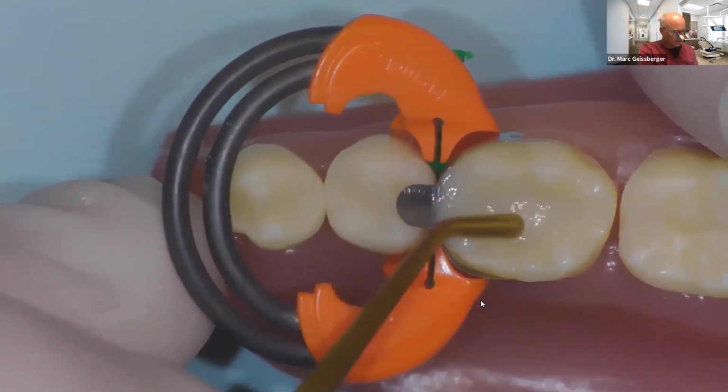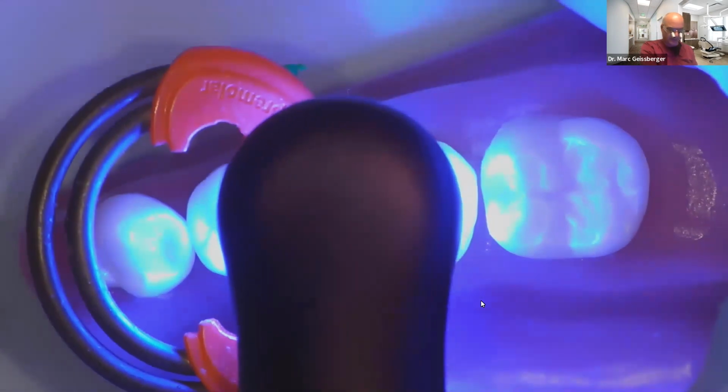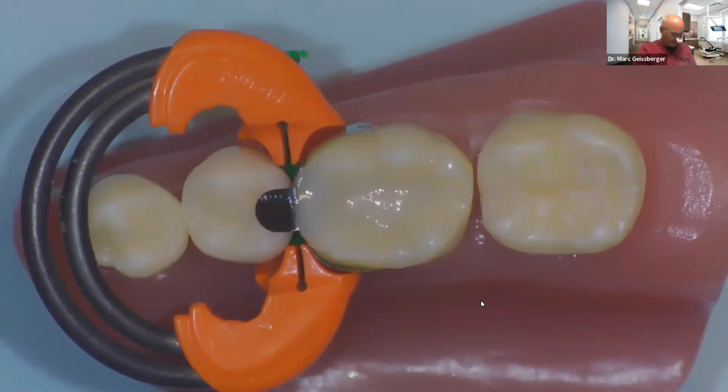Get that leaning to provide a marginal ridge. And now we light cure here. Okay, now I'm going to leave intentionally just a little flash so you can see how I finish that back if you accidentally put a little there. I did that intentionally so I can show you how to do that. Now what I'm going to do is I'm going to go ahead and place another.